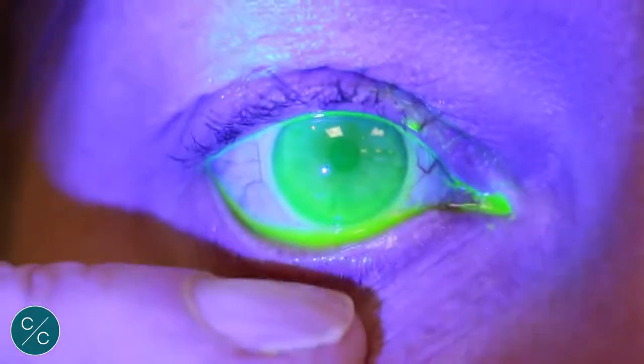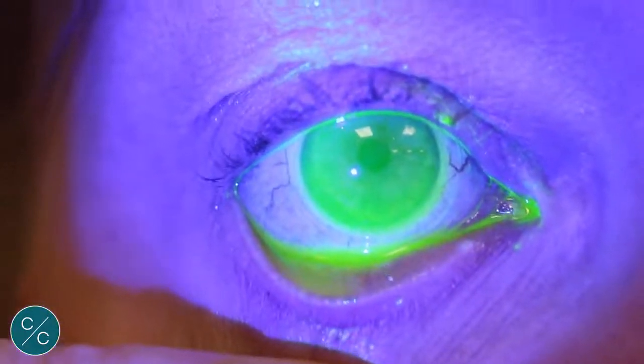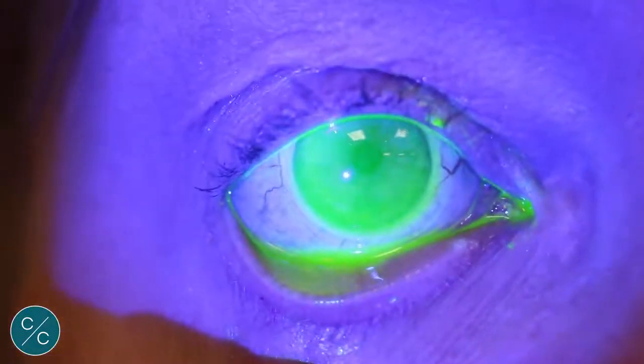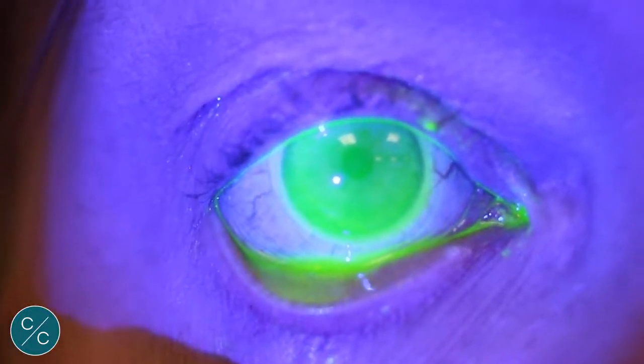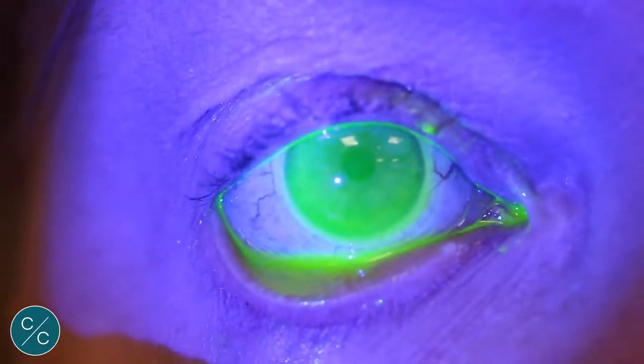So we've changed the lens now, we've gone 250 microns higher and we can see now that there's fluorescent underneath the lens, no air bubbles, so we can proceed with the fitting.